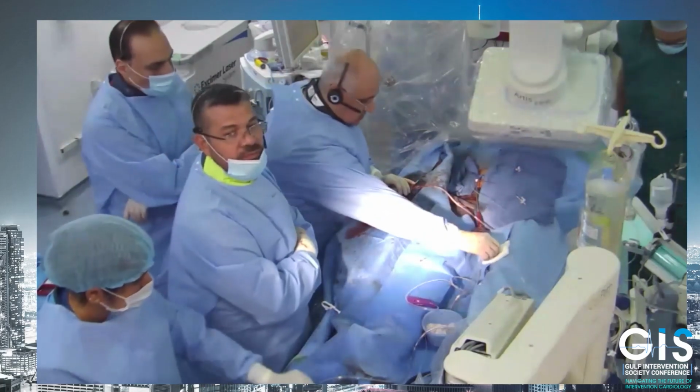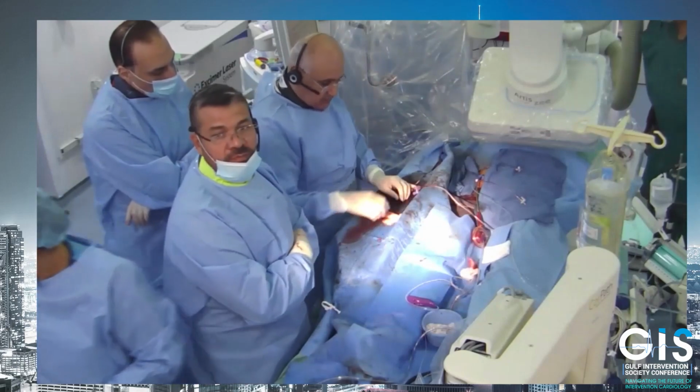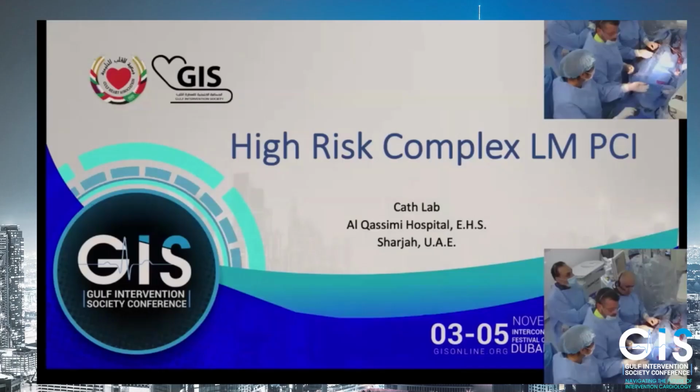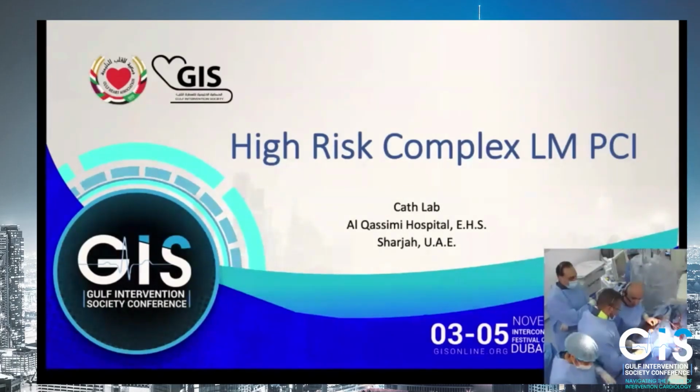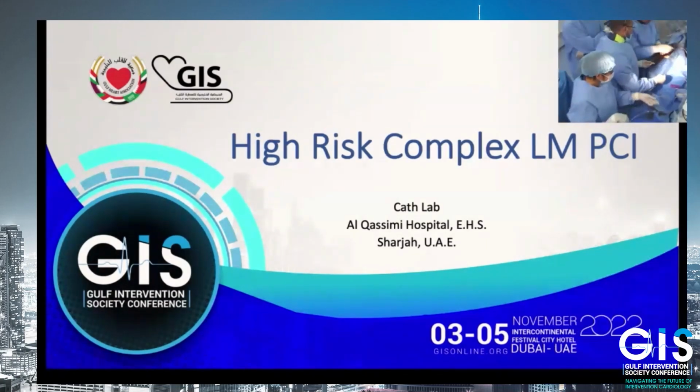Okay, so Dr. Luay Abu Doka will introduce the case, please. Thank you, Dr. Arif. Good morning from Alqassimi Hospital in Sharjah, and congratulations for a successful meeting. I will start with my case. A high-risk complex PCI to left main.